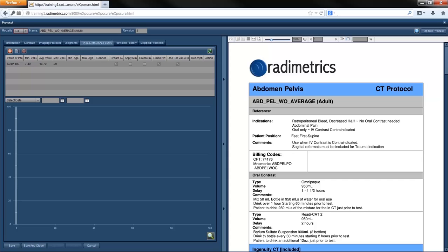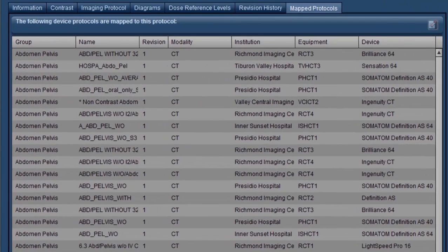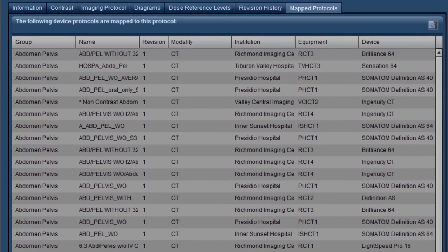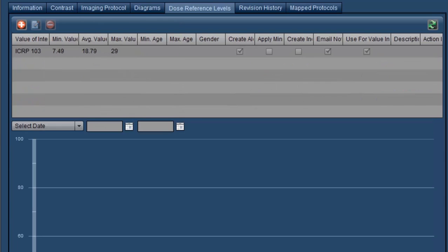The system allows you to map or associate exams coming from multiple scanner types in hospitals in your enterprise to a master protocol. This supports standardization of practice, ensuring that regardless of the hospital, device, or varying technical factors, each exam of a similar type will be measured against the dose reference level set in the master protocol.